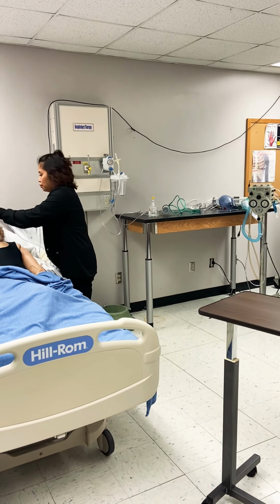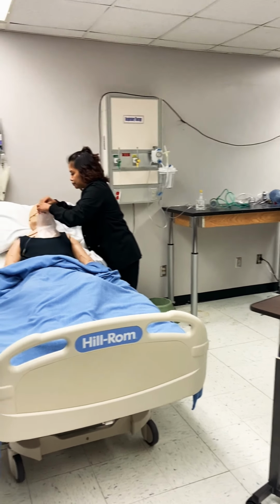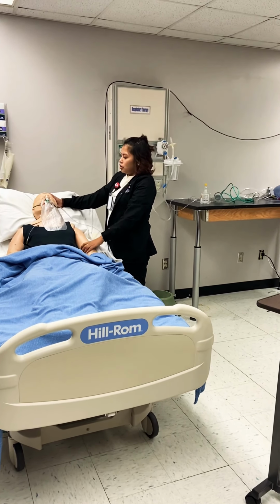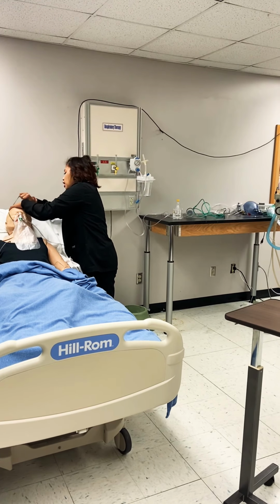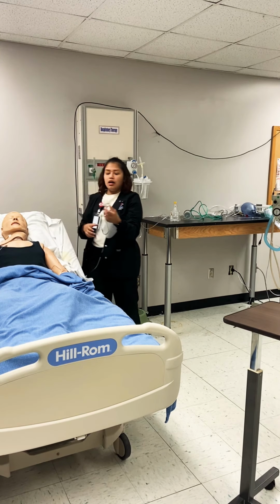So you put it on that, inflate the bag, put it on the patient. And an advantage is you use moderate FiO2 and it's easy to use. A disadvantage is its potential choking hazard and it's uncomfortable.